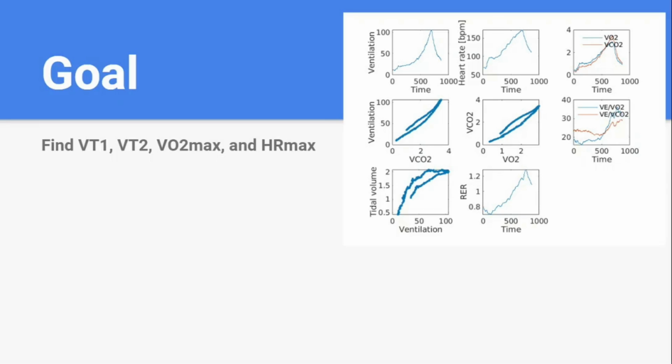But at the point of VT2, the system is overworking, so lactate accumulation increases further. Then the buffering or compensation system cannot catch up with the accumulation any longer, so you cannot continue the exercise for a long time or for a long distance.